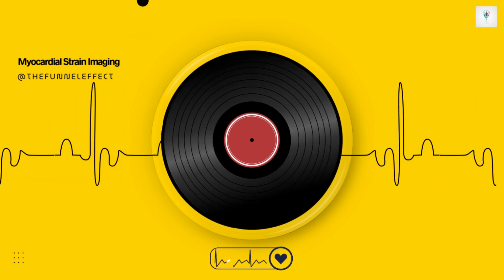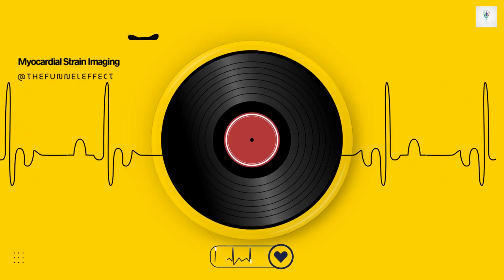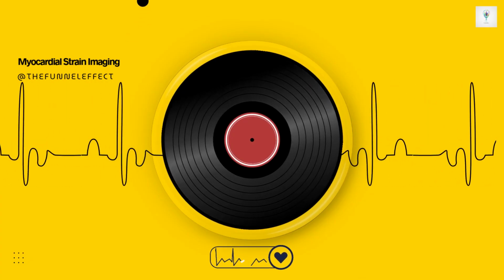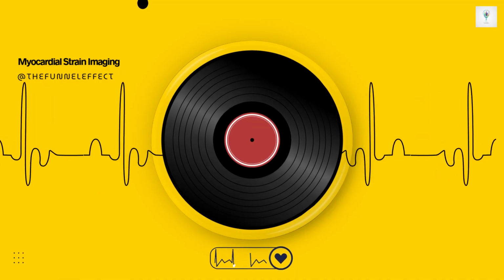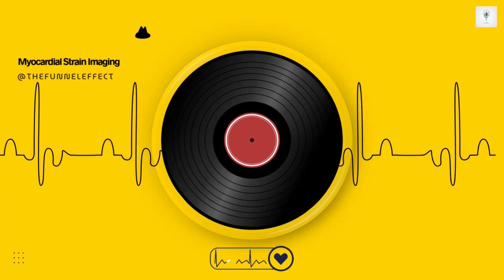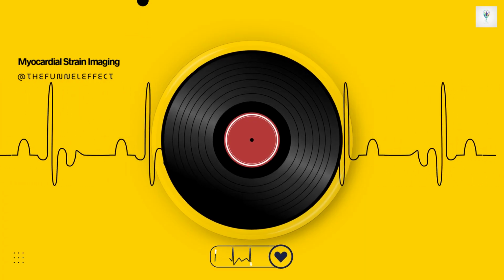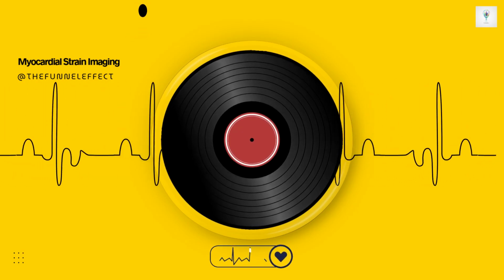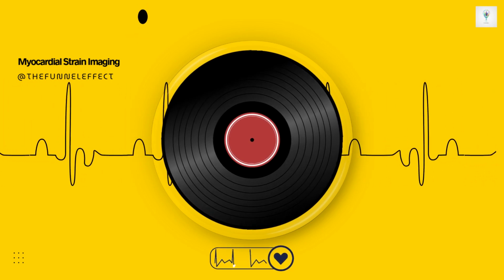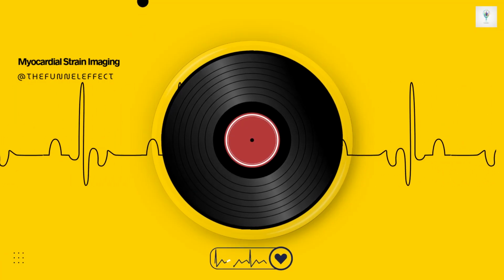Exactly. Plus, you often see this kind of rocking or translational motion of the whole apex, sometimes called apical rocking. Strain analysis quantifies this mechanical disorganization beautifully. And quantifying it helps choose who gets a CRT pacemaker. Yes, it helps predict response. Specific quantitative strain analyses have been developed. For example, the longitudinal systolic stretch index, which basically sums up the amount of that lateral wall pre-stretch and the septal rebound stretch, has been shown to be highly associated with favorable outcomes, predicting which patients will have positive remodeling of their heart after getting CRT.